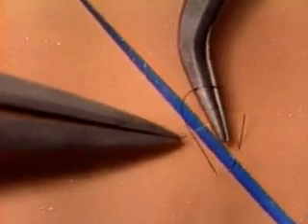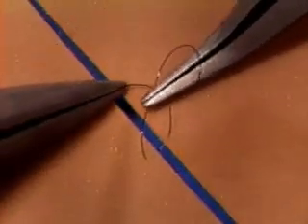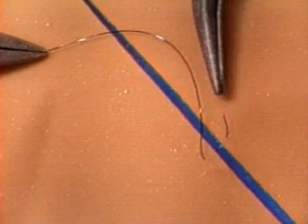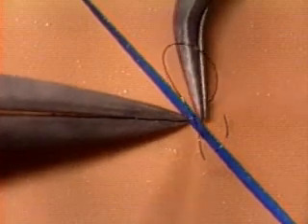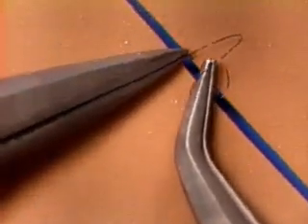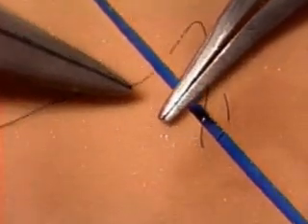Let's just see what happens in loop making when you have your right hand forceps pointing in a few different directions. It's the same sequence every time. Come down on the thread, get the loop started, curl the instrument around it. Come down on it, get the loop started, curl around. It's always the same set of actions. That's it for Act 2.